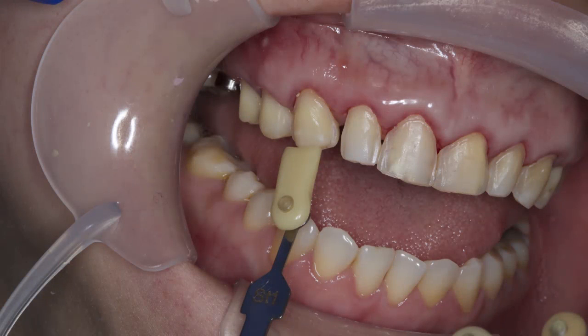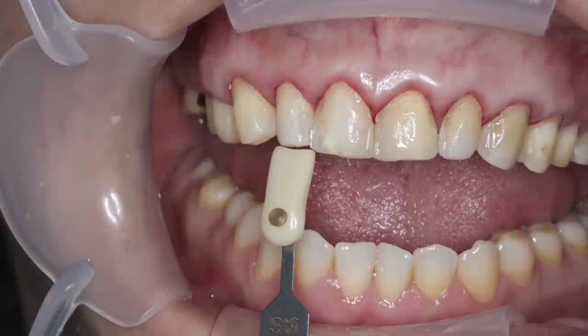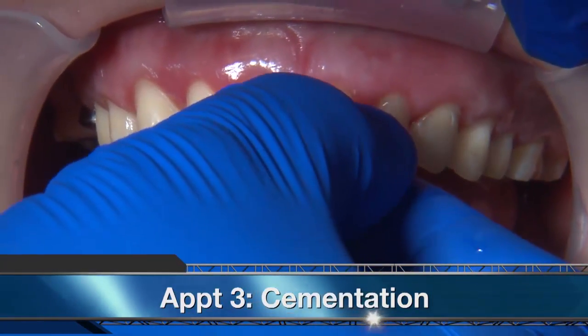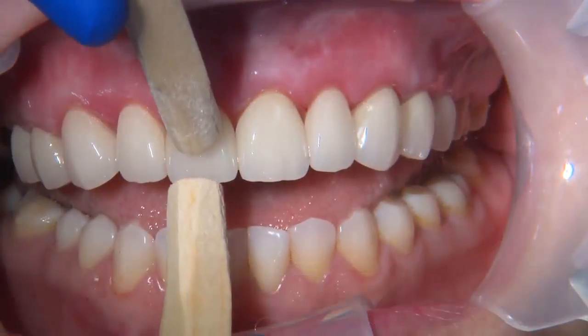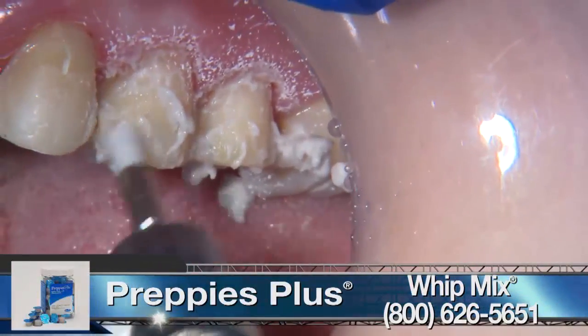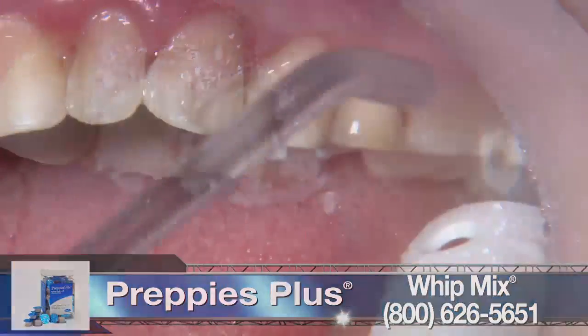In order to better communicate the shade to the lab, a stump shade was also taken. Available in Vita Classic and bleaching shades, obsidian material has great optical properties and it can be pressed or produced via CAD/CAM. At the final cementation appointment, obsidian pressed veneers were tried in with water to ensure color match and that everything fits. At this point, the patient got a chance to look in the mirror and approve her new restorations.